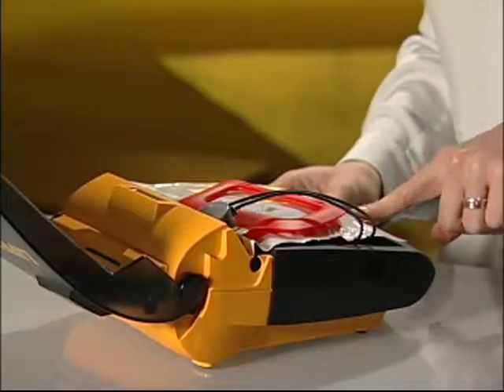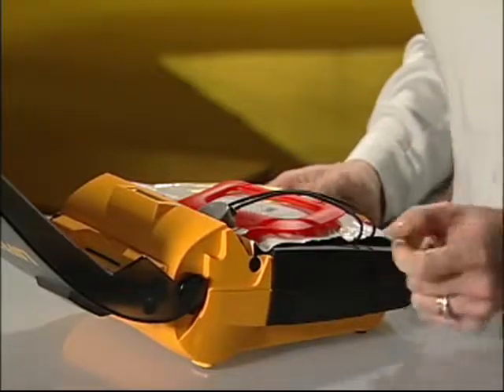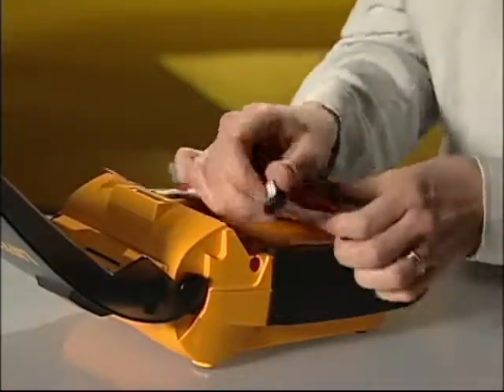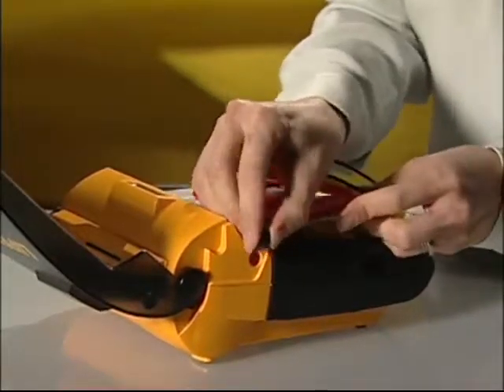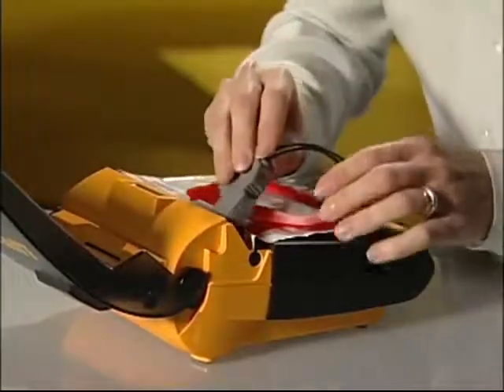Hold down the on-off button to turn it off so you don't use up the battery. Now disconnect the electrode plug like this. Slide out this little pin here and throw away the old electrodes. Put the pin from the new electrode packet back into this same slot here. Plug the connector in.